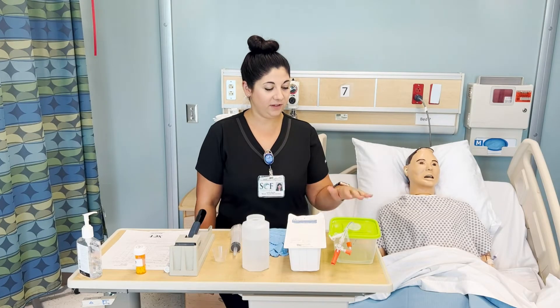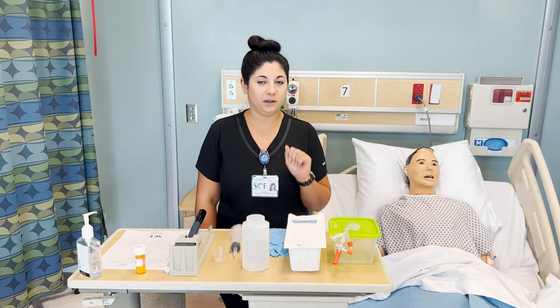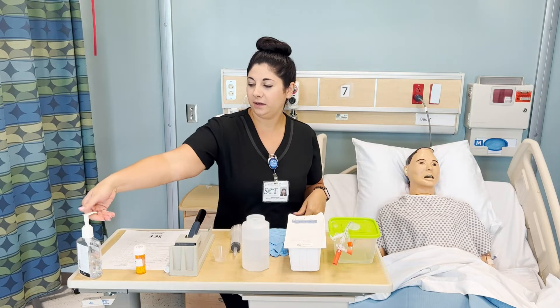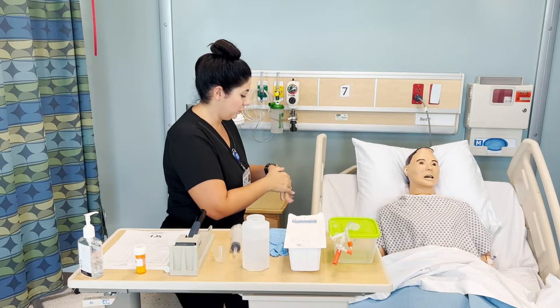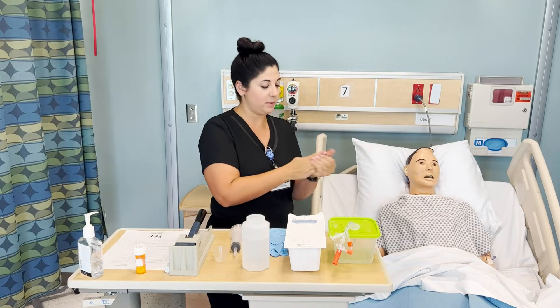I'm going to be giving a medication via a PEG tube. I've already knocked on my patient's door, come in, introduced myself, and provided for privacy. I'm going to wash my hands and identify my patient.